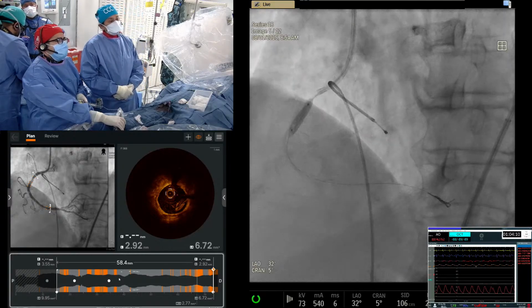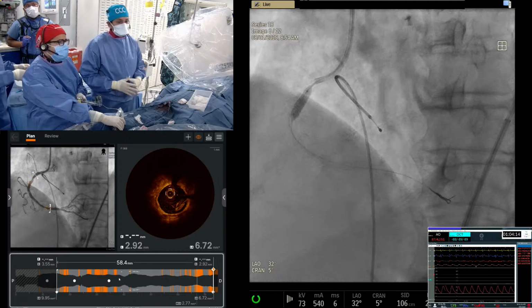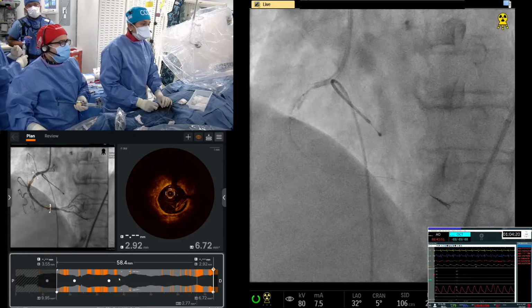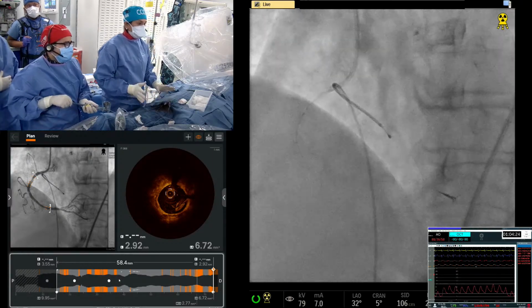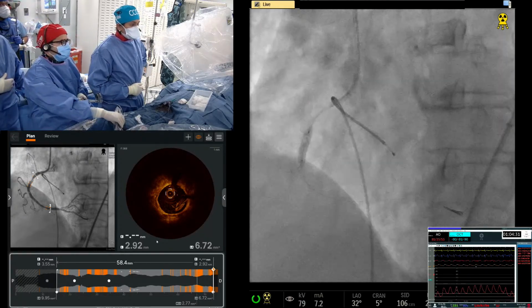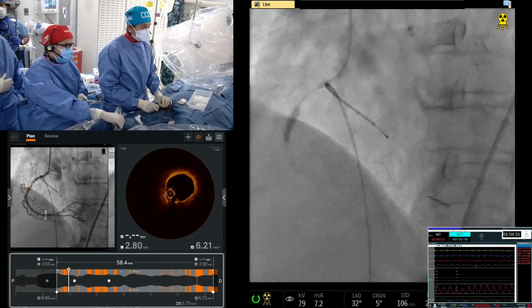This is just, I'm doing cine to show good expansion, which is great. And the way we have done it is good. We did not have any more ST elevation. Hopefully that's good, go up here. So this is the last, I think. Go. Hopefully that marginal branch behaves with the stenting. I want to go a little bit inside, down.